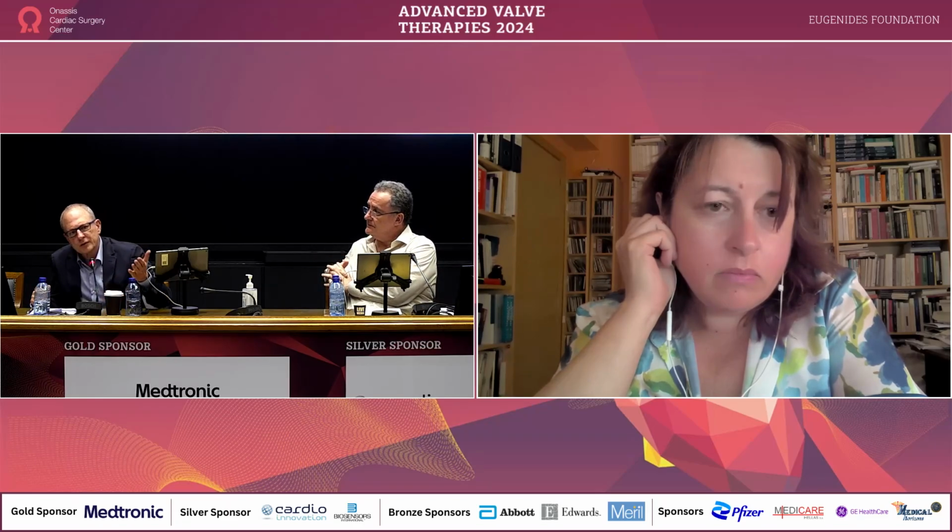I don't know if you notice that discrepancy also in your institution, but this is the reality. And the question comes also because, talking at different meetings, we don't have the SPECT CT, which theoretically would image some flow. So it's nice to hear your opinion on why this is happening.